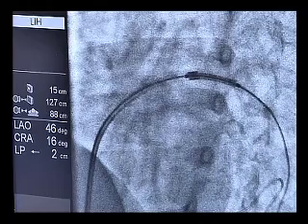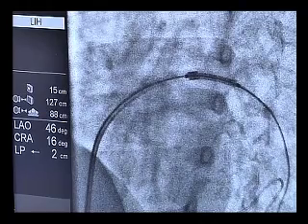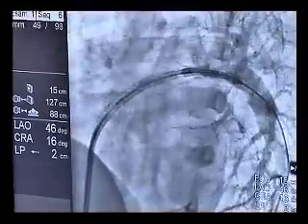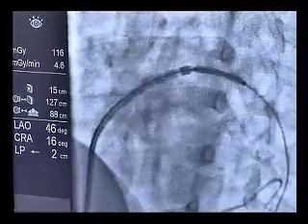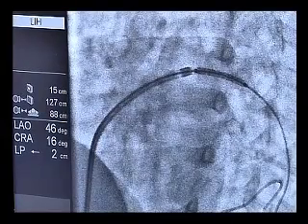Where are the advantages for this stent instead of the Valeo stent, for example? Yes, it's the same thing. It's the same category of stent. We are starting to use this one instead of the Valeo stent, but it has the same advantages. You said before this was a pre-mounted stent. Can you just tell me what size balloon that is on and what's the final diameter you can achieve with that stent?